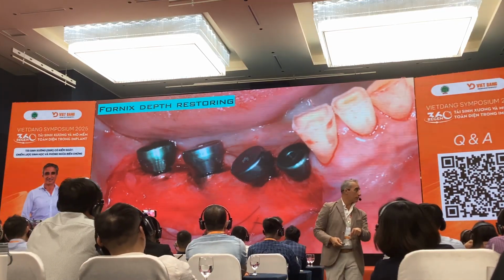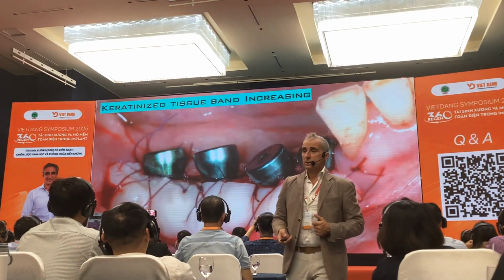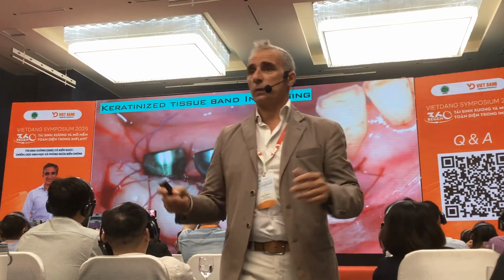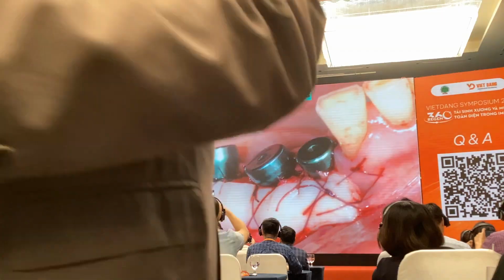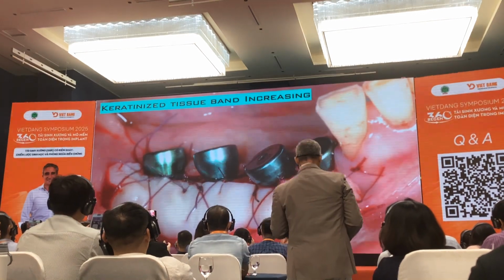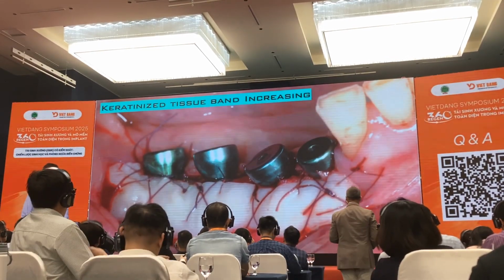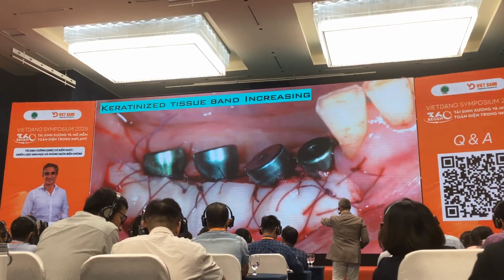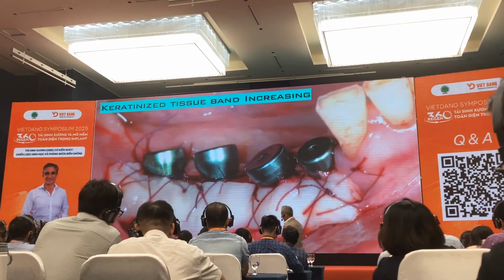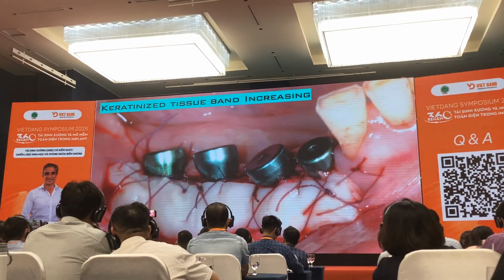I activated the implants contextually, and then I grafted a big free gingival graft. Stabilized against the vascular bed with several crossing and pressing sutures anchored to the periosteum and against the healing abutment, in order to limit the risk of necrosis of the graft.